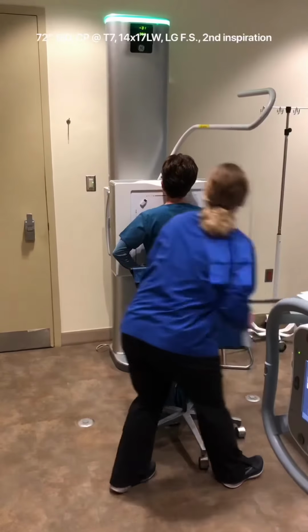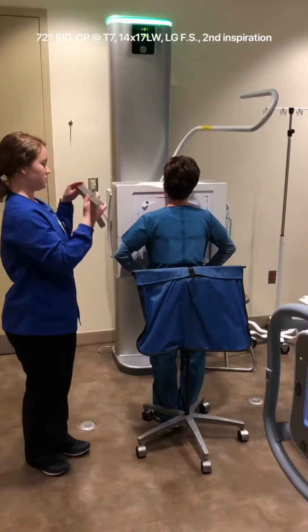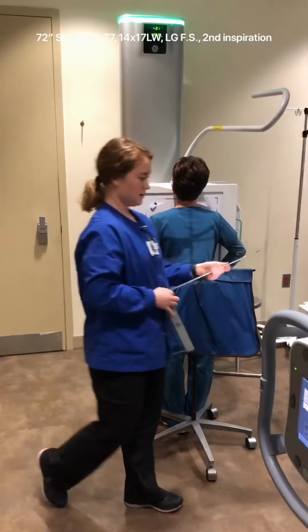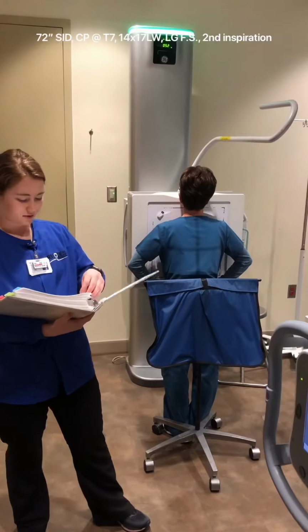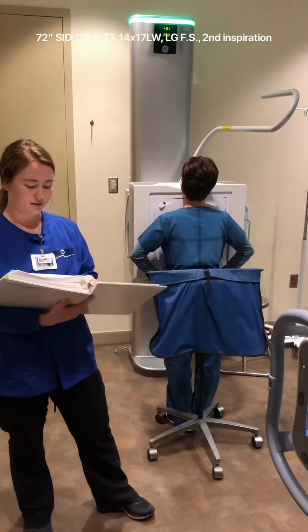Once you have them all set up, you want to measure where the beam goes through the patient front to back. She measures 20 centimeters. Then you're going to get your exposure chart out to set your exposure. 20 centimeters puts you at 91 kV and 12 mAs.